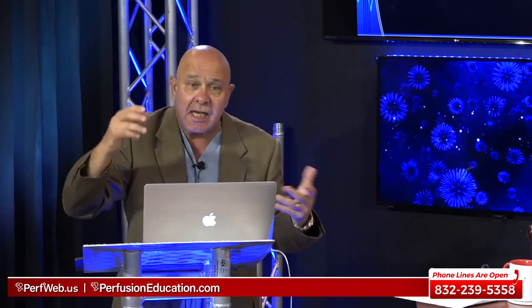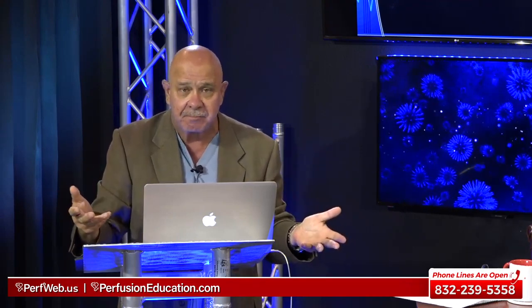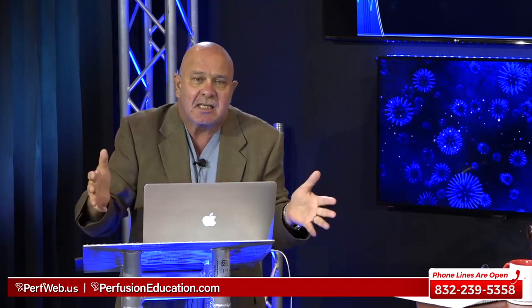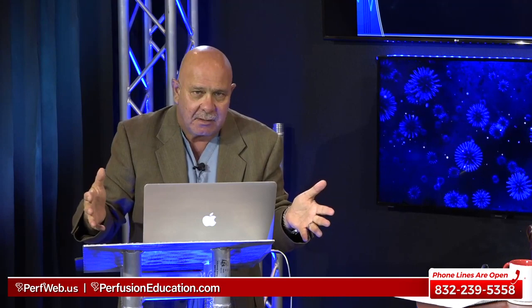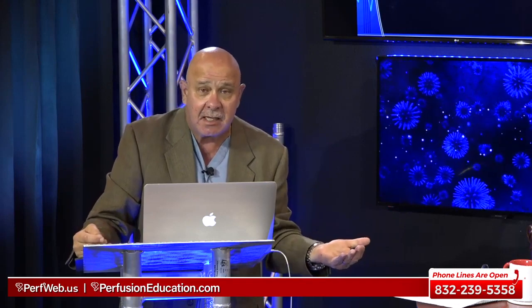The tank, being the vascular system, is set up to accommodate this much volume for the heart to be this full, to be pumped around back and forth to the tissues. If I increase the capacity of it by dilating the patient, then we are creating hypovolemia. So a low CVP does not necessarily mean the patient needs fluid.